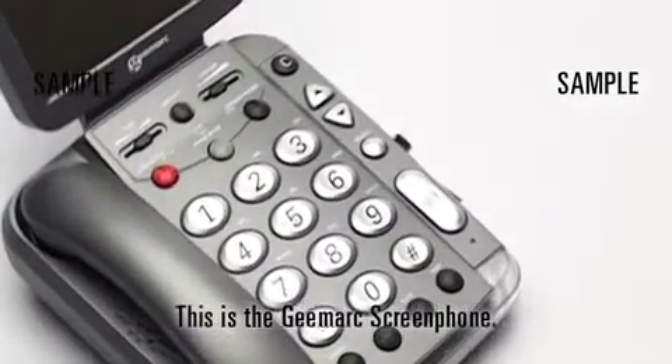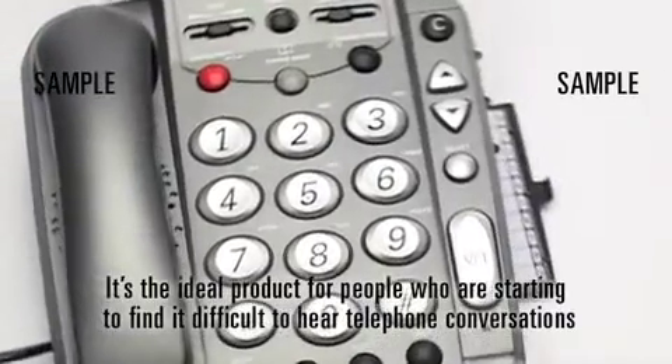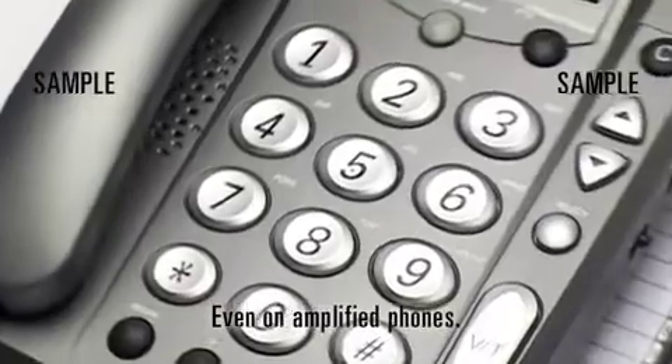This is the Geemarc ScreenPhone. It's the ideal product for people who are starting to find it difficult to hear telephone conversations, even on amplified phones.